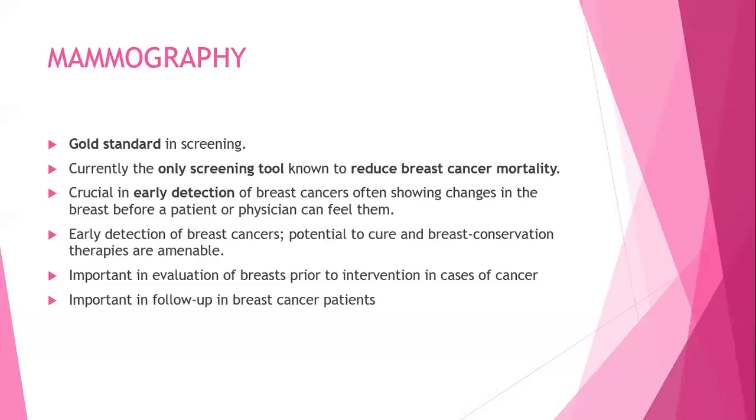Mammography, as I've also talked about, in patients who have had a breast cancer diagnosis, it is important to have that baseline mammogram so that in future, when we are doing comparative studies, we are able to know if there's been any response, especially where breast conserving surgery has been done, or if you've had a patient with unilateral mastectomy. The other thing is sometimes you may have, in rare cases, patients who have bilateral breast cancer. So in such cases, you may find a breast with a lump that is palpable, and the other breast has abnormalities, maybe microcalcifications that may not be palpable clinically.